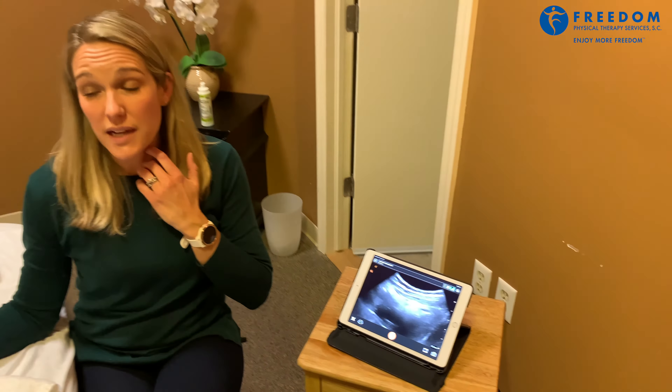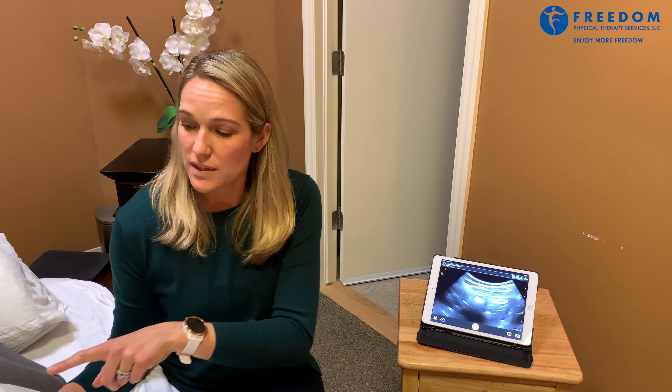A nice thing about this type of ultrasound is that it's portable. We can then have the patient come up off the table and do something very sport-specific or activity-specific, like lifting her child from the ground or doing a tennis swing, and have her contract that muscle — and we can see on real-time ultrasound when she's doing that or not.